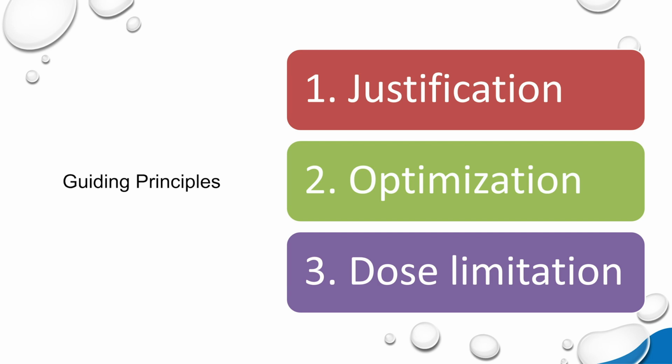And also the third guiding principle is that you have to limit the dose exposure to your patient, meaning that you're going to try to find the exam that's going to give you the most information and that will expose your patient to a minimum of radiation. So those are the 3 major guiding principles that we use in radiology, because we follow what we call the ALARA principle, which is as low as reasonably achievable.